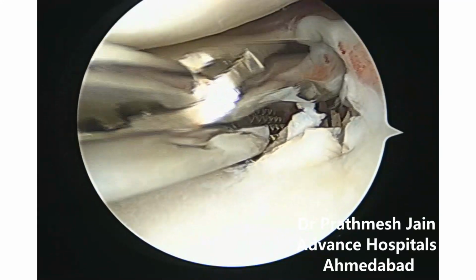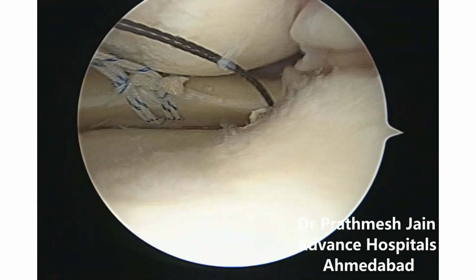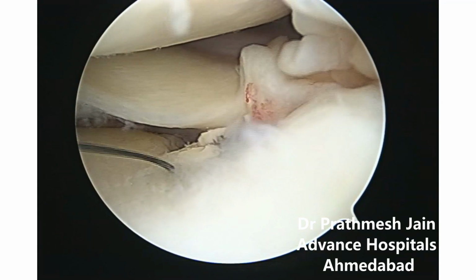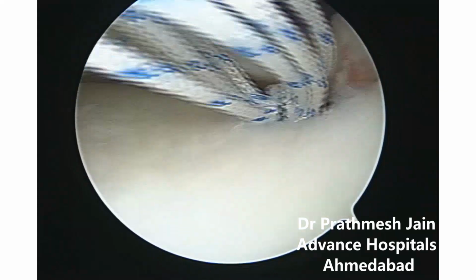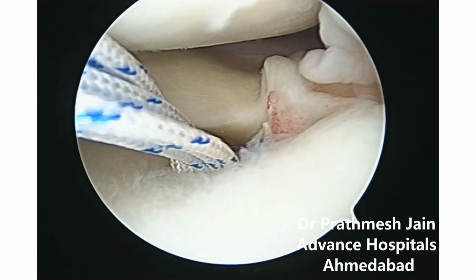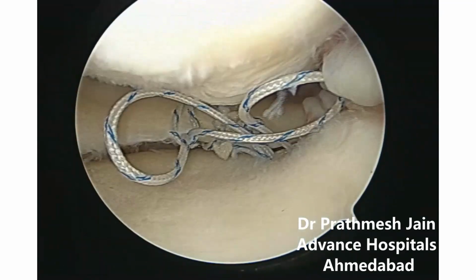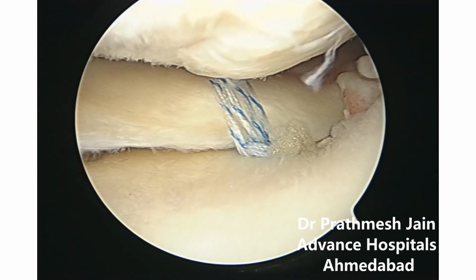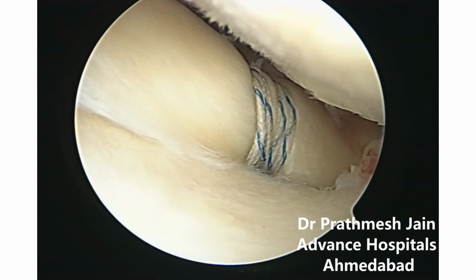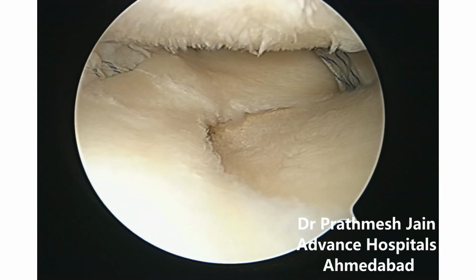After that, we will pass the suture passer through the tunnel that we have made, and we will railroad all four suture limbs through the tunnel back to the tibial footprint. Once these sutures are passed, all the sutures will be tied on the anterior aspect. We'll pull it up, and with this pulling you can see that the meniscus root is now attached back to its original footprint. Once it is done, we can tie it on the front of the tibia using any fixation modality. I personally prefer a plain endobutton to fix these. You can use a screw or you can use a washer as well. You can see that the root is nicely repaired.